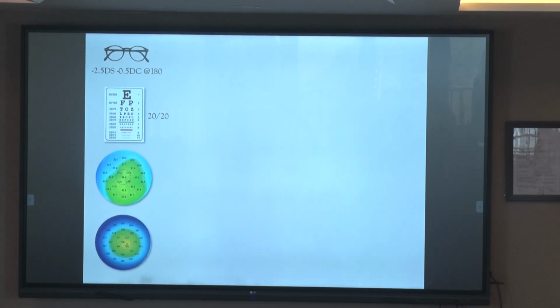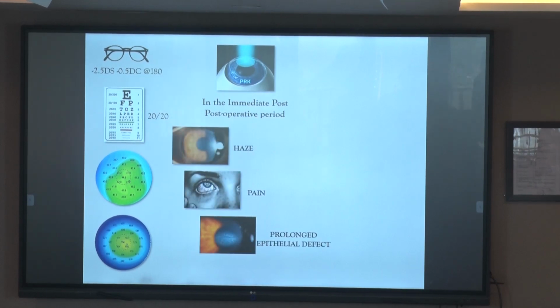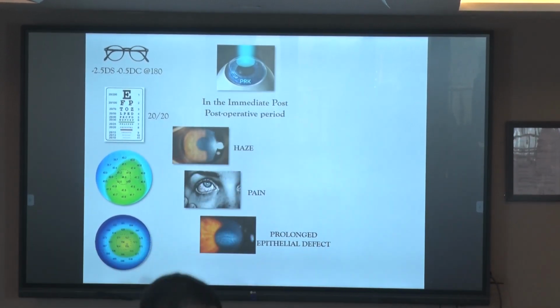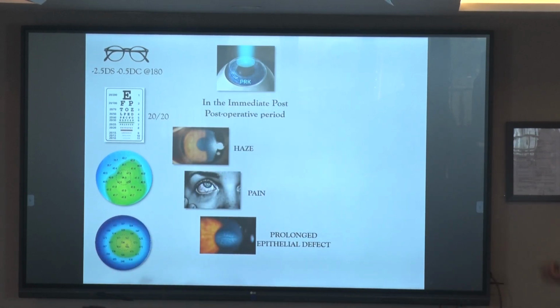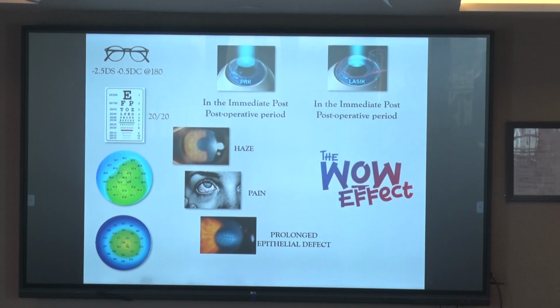Now, the reason for this is very simple. In the immediate post-operative period following a PRK, we very often, and we all have seen it over the years, in spite of wound modulation, in spite of various other factors, there is pain, in spite of the contact lenses with AccuVeil used, in spite of the MMC used, there is haze, there can be prolonged epithelial defects. Whereas in the immediate post-operative period following a LASIK, all that you have is nothing but a wow effect.